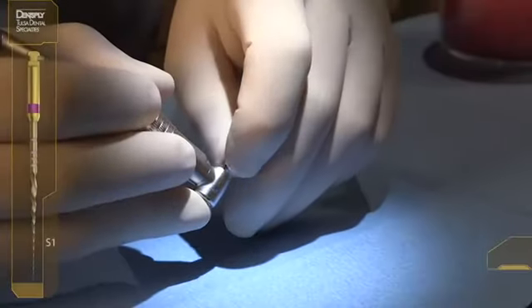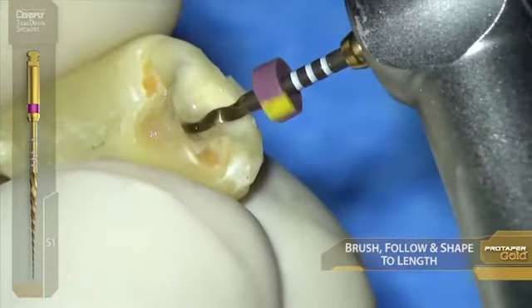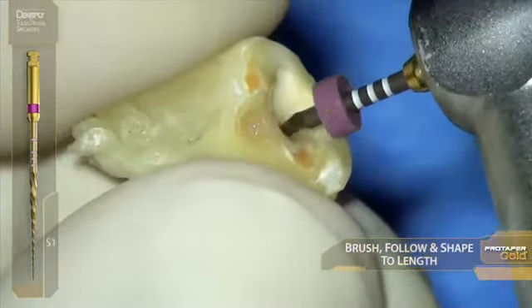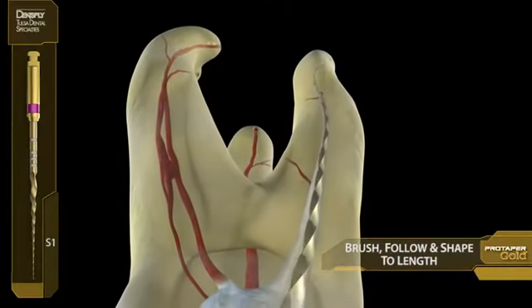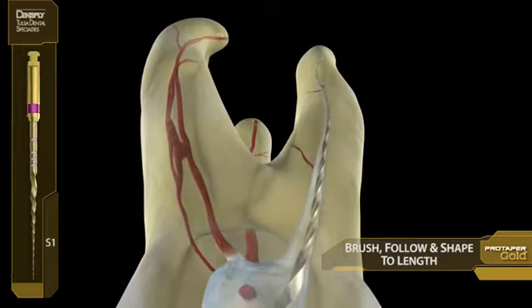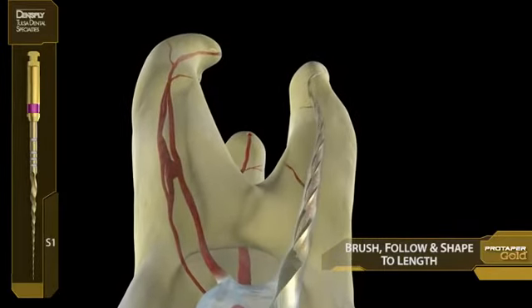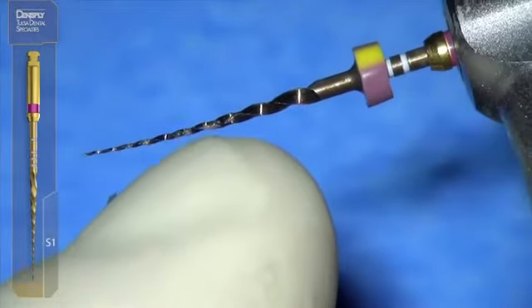Well, it's time to remove restricted dentin and connect the dots. So purple S1, watchwords are brush and follow, brush and follow to length. Brush and follow, brush and follow. You might want to say that to yourself. Notice the restrictive dentin is removed.